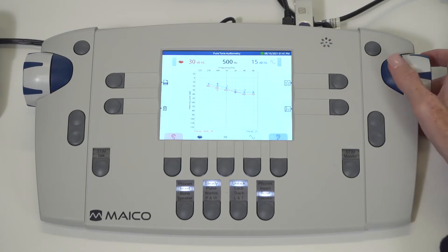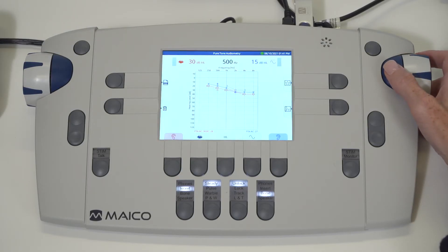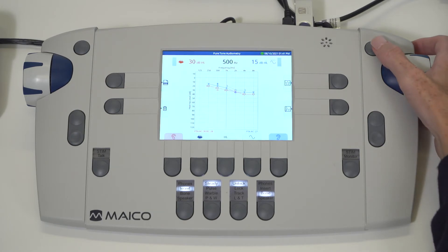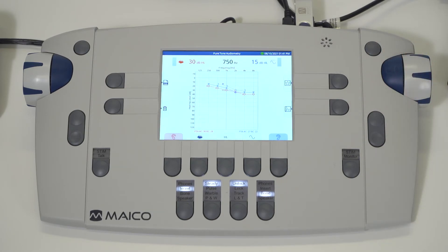Save individual thresholds and speech scores using the S key as you conduct the test. Once the test is finished, the audiogram results can be saved in several ways.